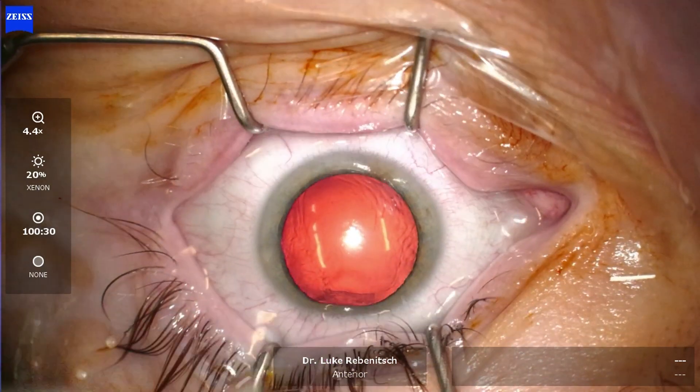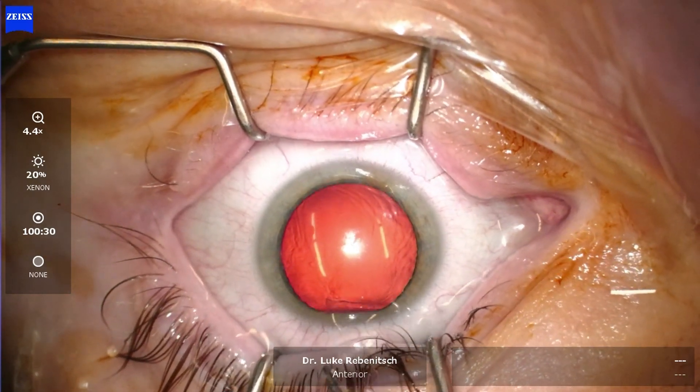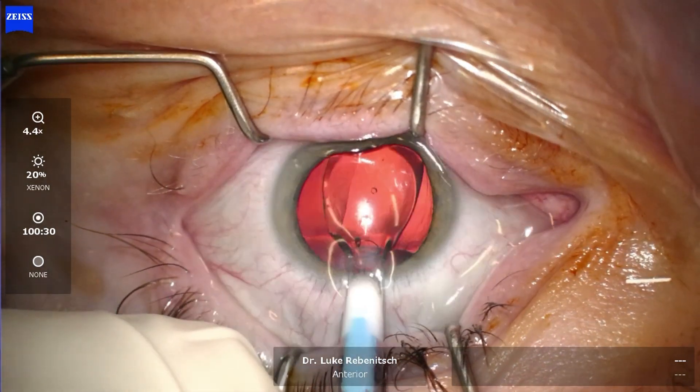We are now placing the Evo ICL. As you'll see in just a moment, we are going to unroll it in the correct orientation inside the eye. This patient is highly myopic, or highly nearsighted, and is going to benefit greatly from this procedure.